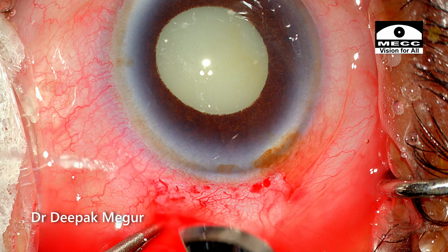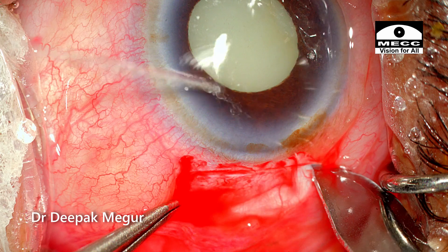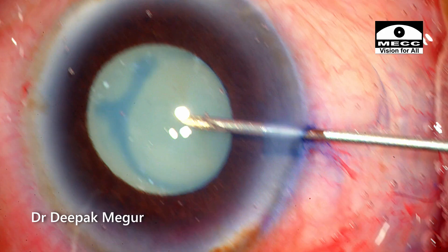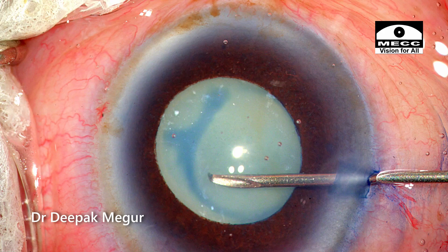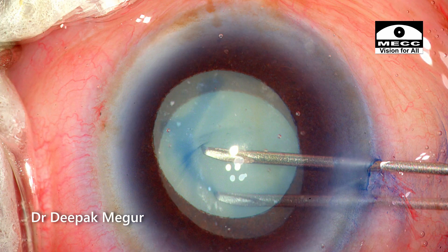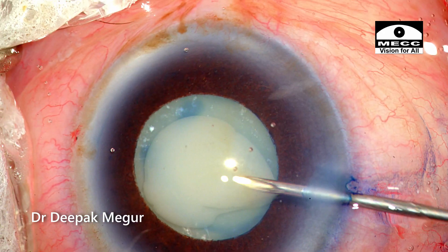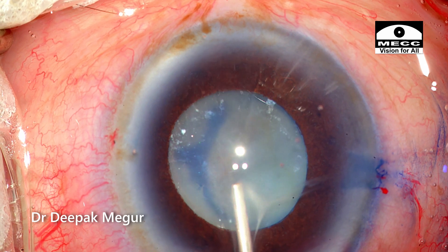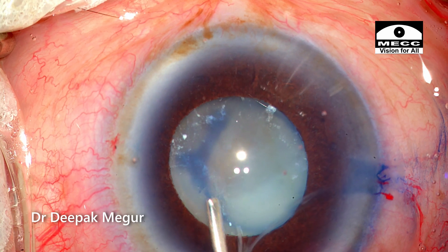To summarize: temporal incision in SICS is extremely useful in controlling low to moderate degrees of pre-existing against-the-rule astigmatism. This case deserved extreme gentleness during handling of the capsular bag, as the entire capsule-zonule apparatus was very weak and salvaging it was a challenge. If I had to be very critical of myself, probably if I get a second chance, I would have spent an extra couple of minutes to irrigate out all the liquid cortex in one go.